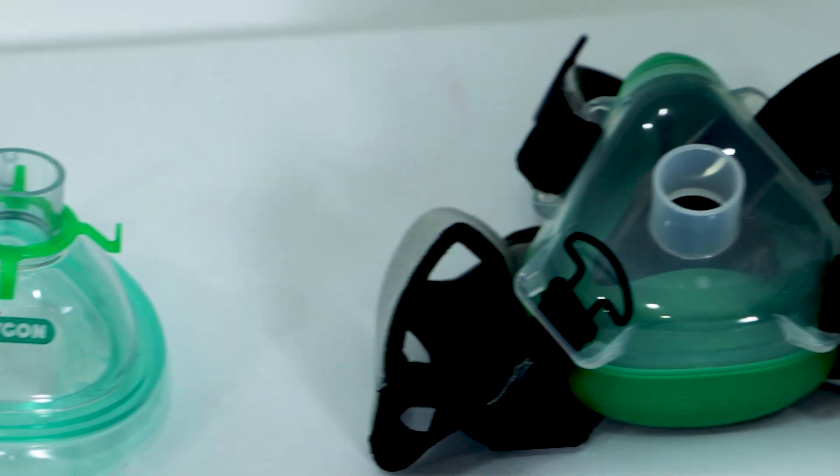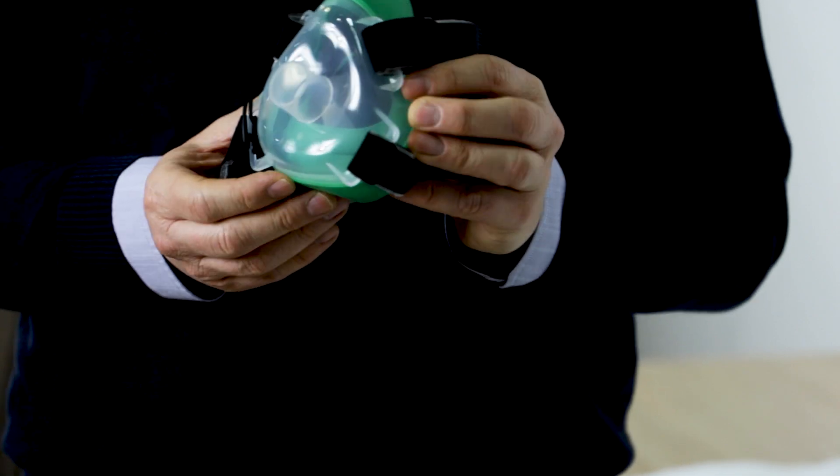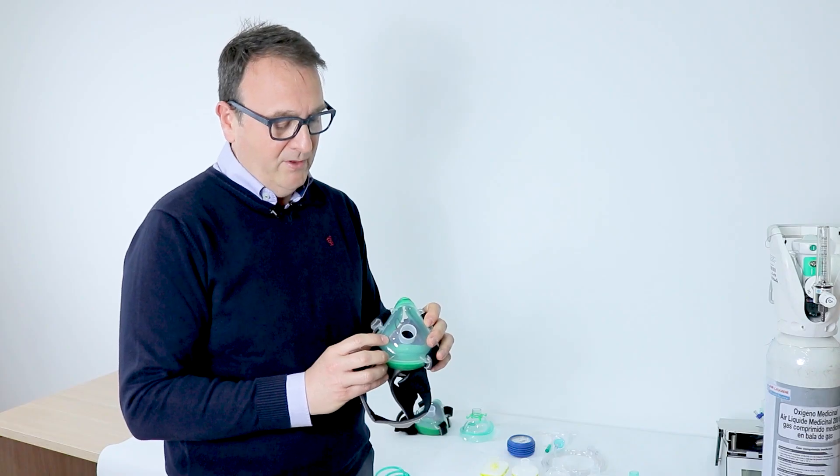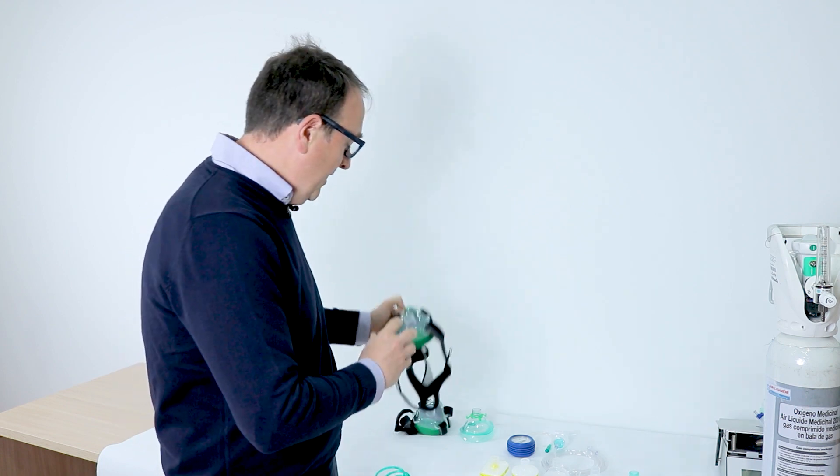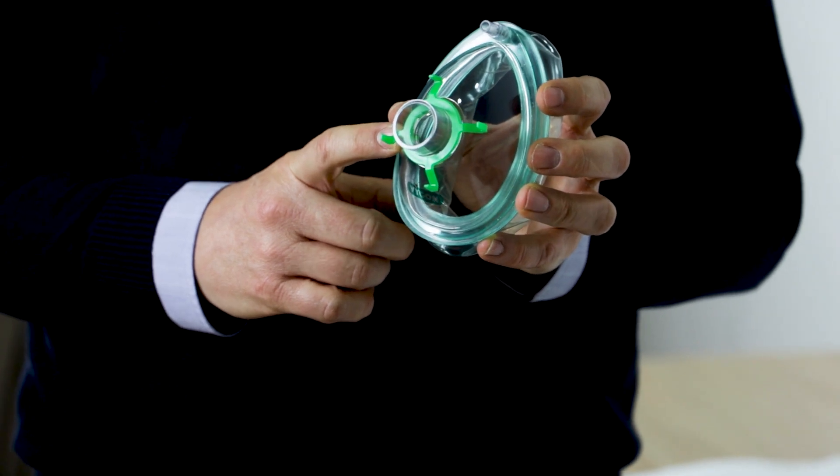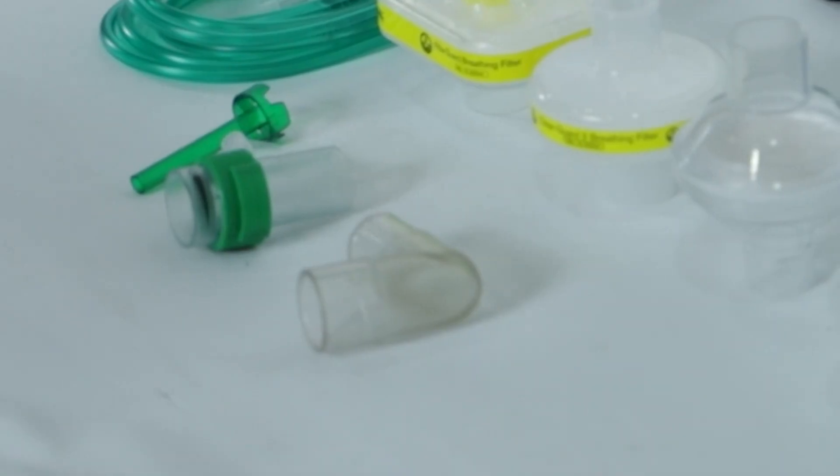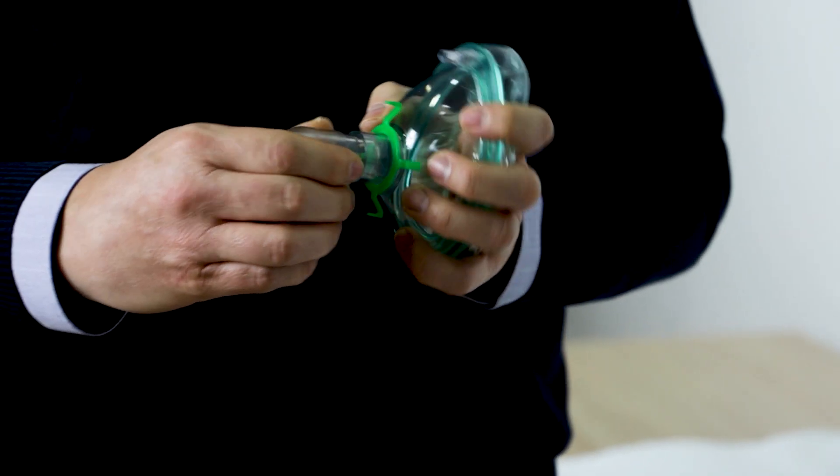First of all, I'm going to show you how to assemble the filters in the Boussignac CPAP systems. The first step is to choose the face mask. We can choose whichever. This face mask is a very comfortable valve face mask for the Boussignac valve, or we can use this one that is available in some European countries. The first step is to fit the elbow. We are going to put here the elbow. It's an ergonomic elbow.